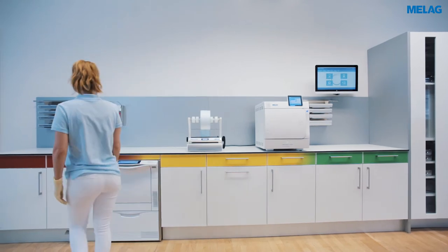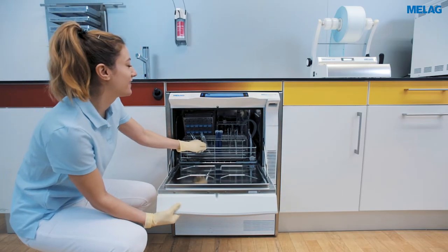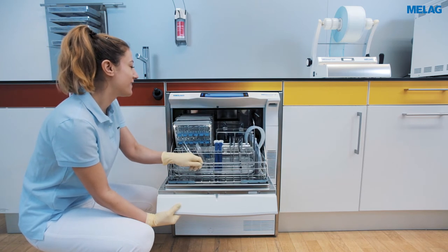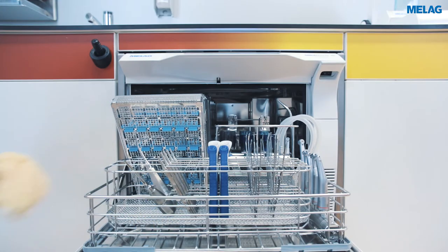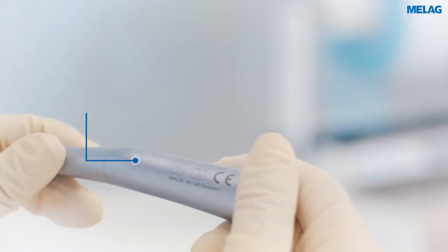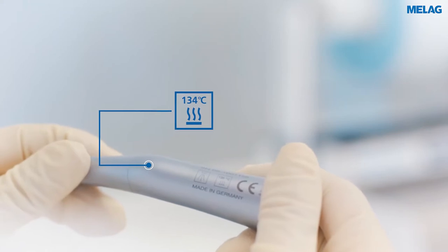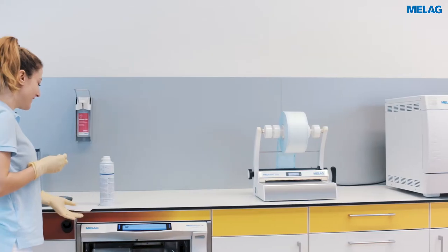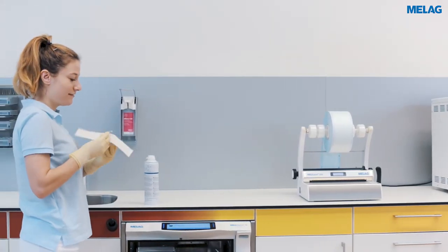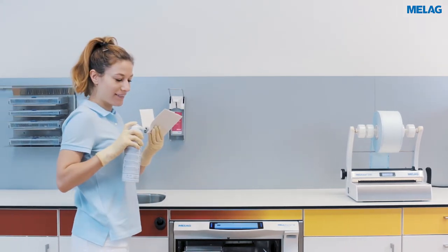Sterilization requires correct cleaning and disinfection of instruments. The Melag washer disinfectors combine optimal process outcomes with time-saving workflows. Please familiarize yourself with the manufacturer's specifications of your instruments. Do not use any water repellent agents, steam impermeable oils for lubrication and care.